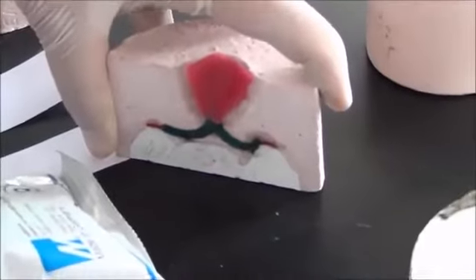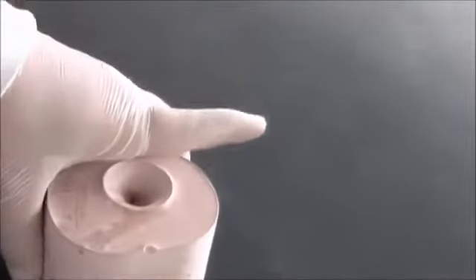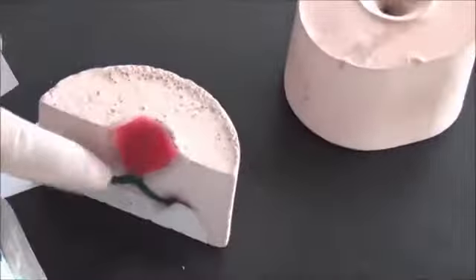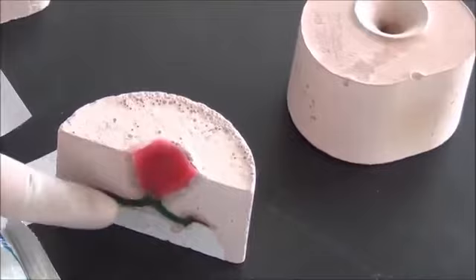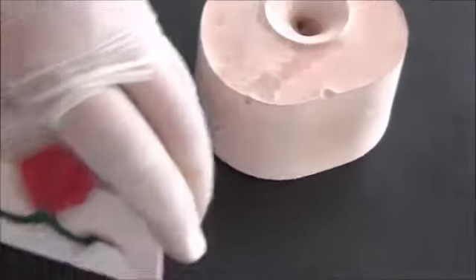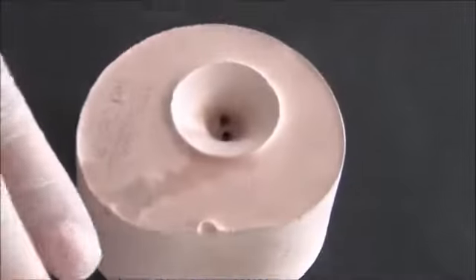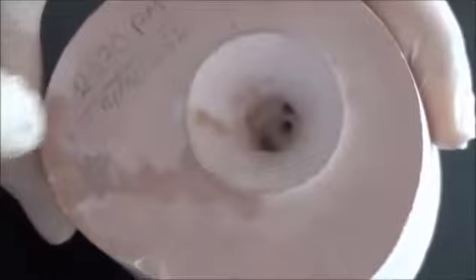This is ready for a step after, called burnout, because all of these spaces are filled with wax. We don't want them filled with wax. We want this wax to go out. So we do a process of burnout, where this is placed in an oven at high temperature. The oven will melt down all of the wax, and what we will have at the end is this investment material with empty tunnels that follow exactly the same shape that we had in wax.